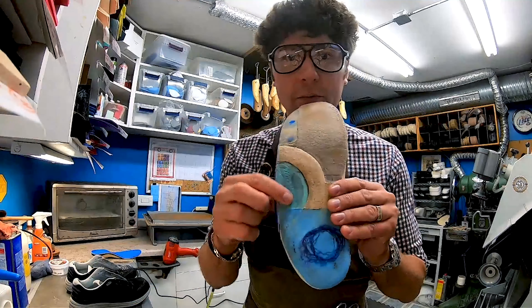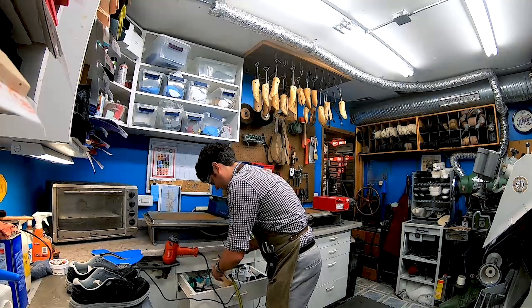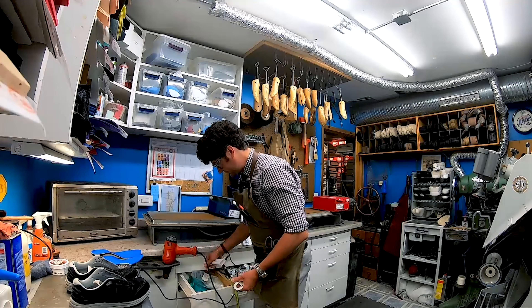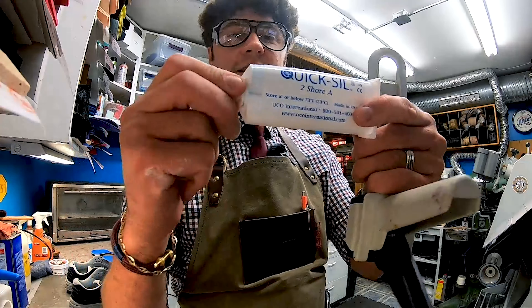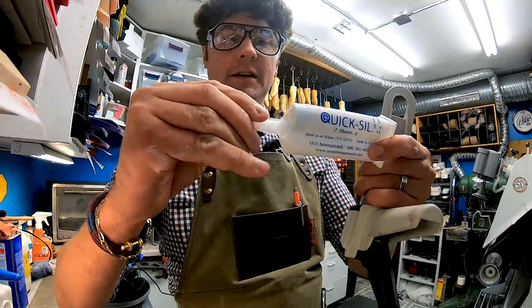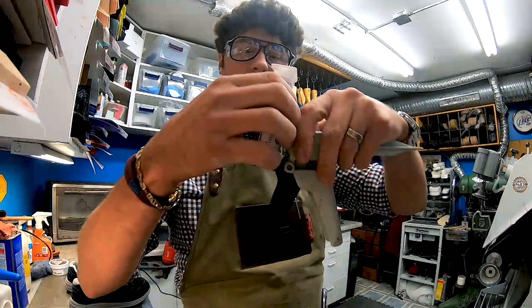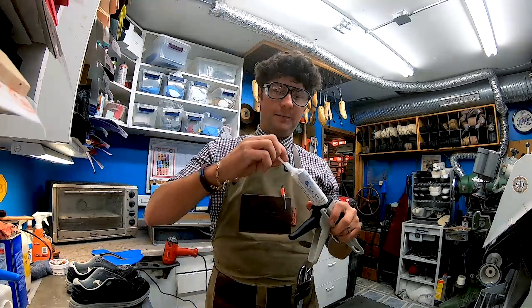We're taking a look at the orthotic and we'll do a little clean-up job on there too. Yuko International is a great supplier of the Quicksil medical grade silicone — it's a two-part combination that creates a really nice offloading zone for the feet. We're going to load up our silicone gun and get that prepped up.